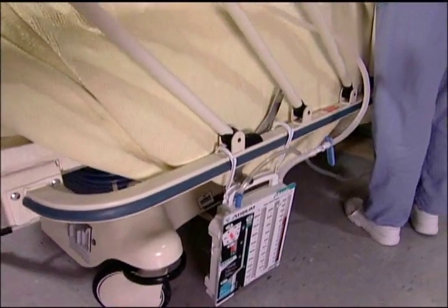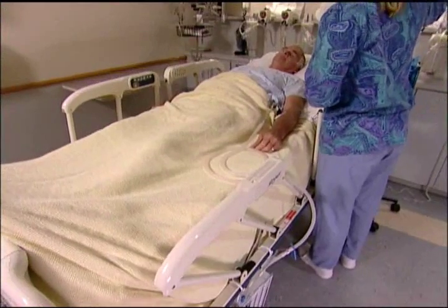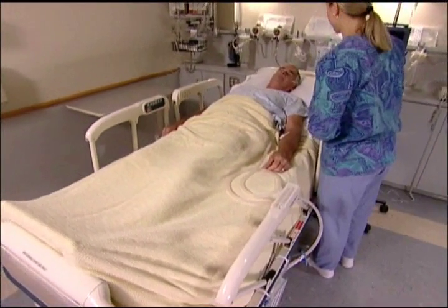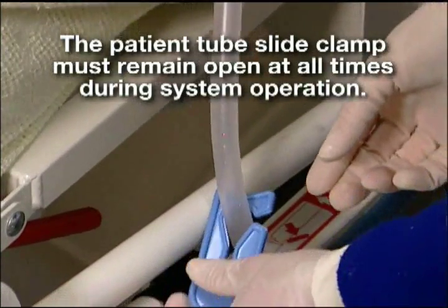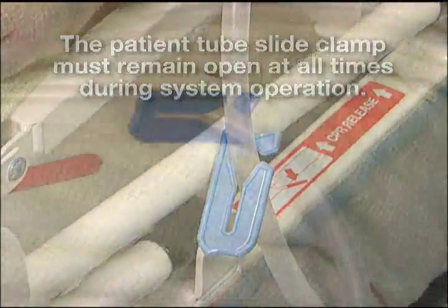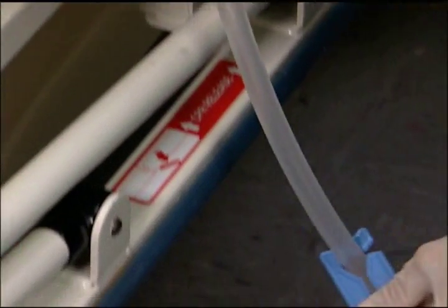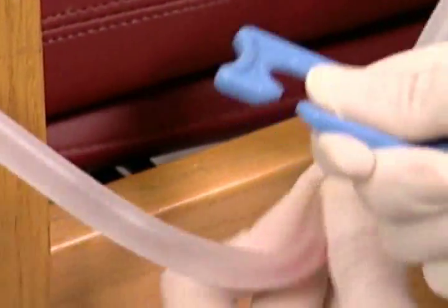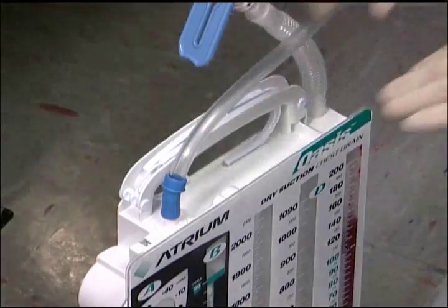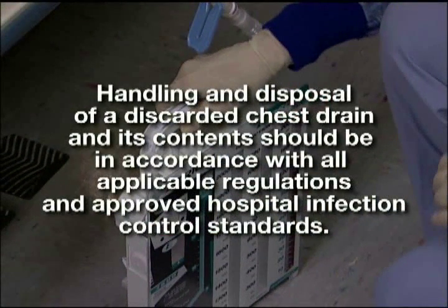Most healthcare facilities routinely use suction for their patients as it helps improve the rate and flow of fluid drainage from the patient and out through the thoracic catheters. The patient tube slide clamp must remain open at all times during system operation. It's recommended to position the patient tube clamp next to the inline connector for setup convenience and routine visual check. The patient tube clamp can be removed if desired. Handling and disposal of a discarded chest drain and its contents should be in accordance with all applicable regulations and approved hospital infection control standards.